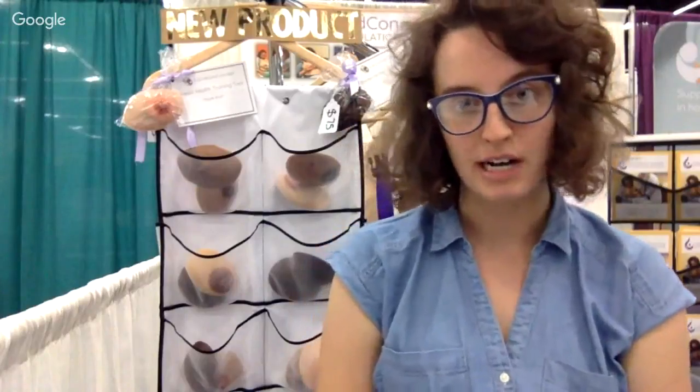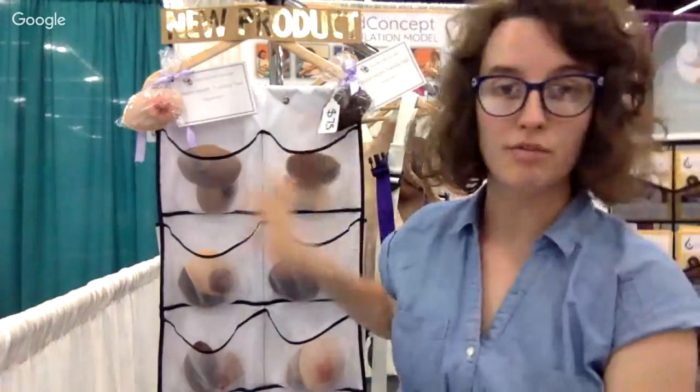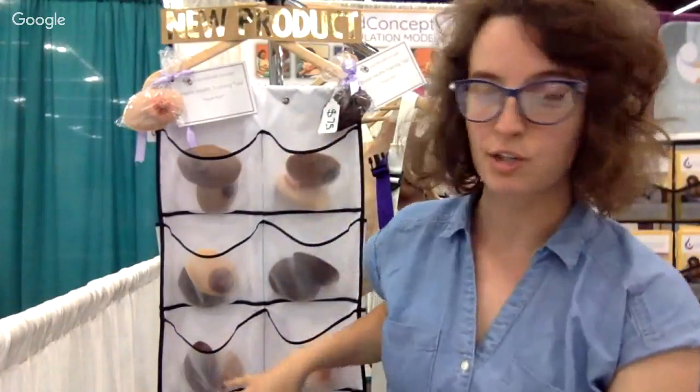Hi everyone, my name is Anna. I'm the CEO of Liquid Gold Concept, and today I wanted to show you our brand new set of products. They're called Breast Health Training Tools.